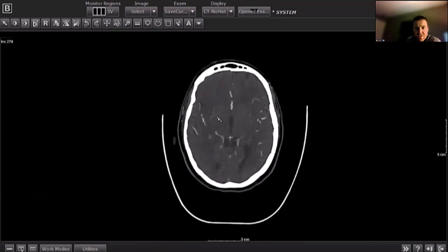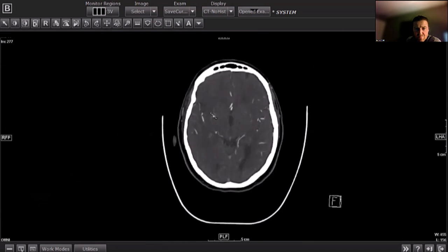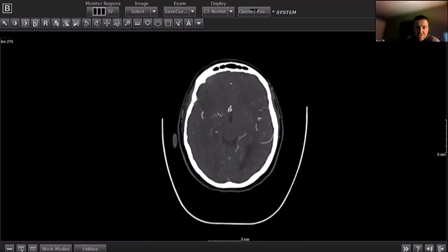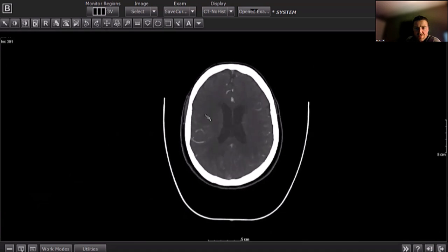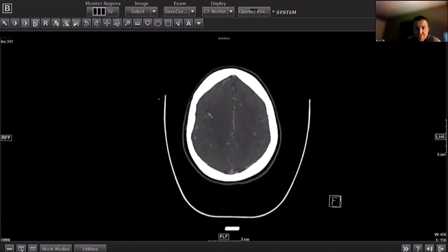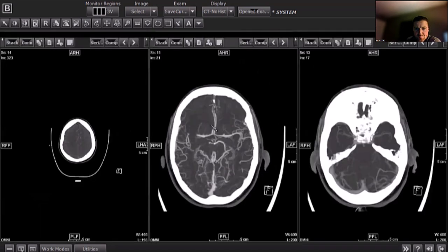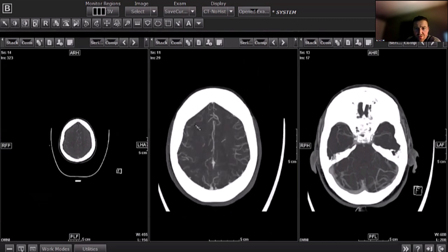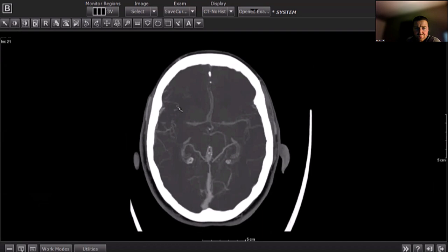you can see that there's an abrupt occlusion of the superior M2 division near its origin. So again, a proximal vessel occlusion. We have quite a paucity of vessels on the arterial phase in the expected territory supplied by that division. Starts to fill in, but again, not good caliber, not good contrast density in that region. And then on the second delayed phase, again, not great.